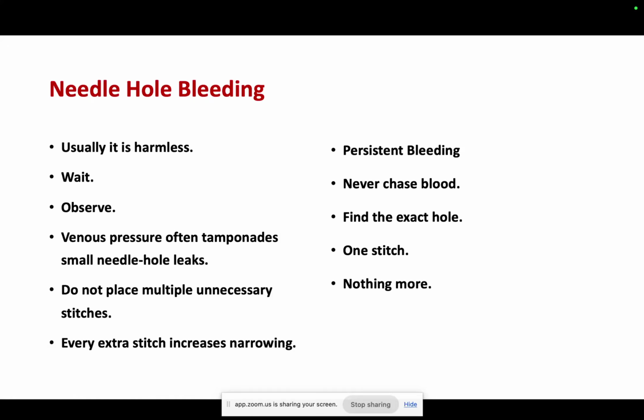Yeah. If you're going to complete the anastomosis with a single suture, you are not tying the posterior wall separately and the anterior wall. So the whole circumference has to be taken into consideration, and then we use the diameter.